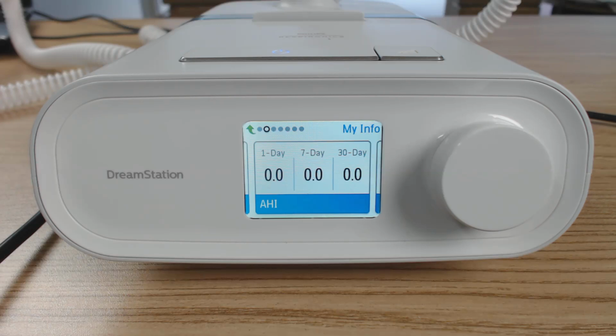If we rotate one to the right, AHI, now this is Apnea Hypopnea Index. Apnea-hypopnea index is how many times per hour there are events happening. And by events, we're talking apneas, hypopneas, any sort of sleep-disordered breathing events, which we want to minimize. So we try and get this number less than 5. That's the goal of the therapy.